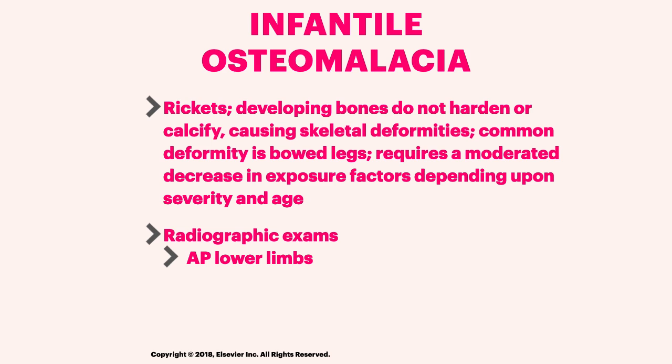Infantile osteomalacia, rickets. Developing bones do not harden or calcify, causing skeletal deformities. Common deformity is bowed legs. Requires a moderate decrease in exposure factors depending on severity and age. Radiographic exams are an AP lower limb.